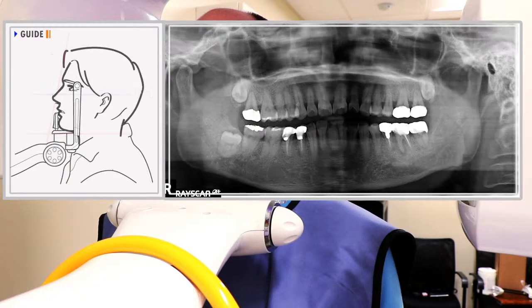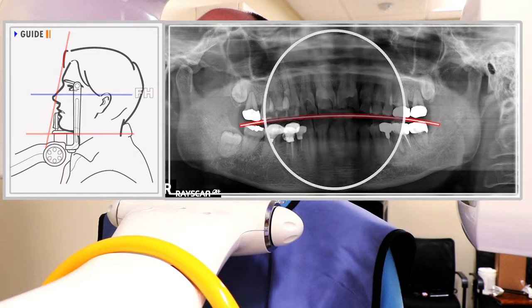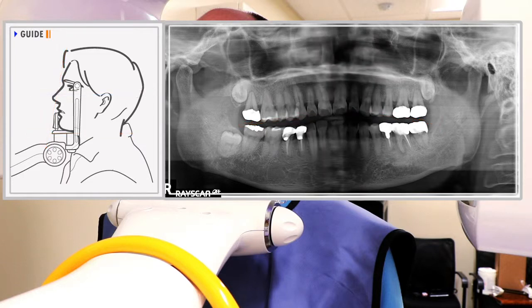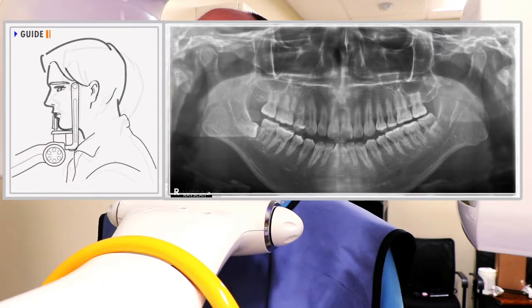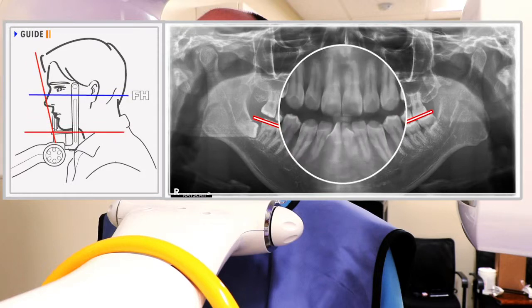If the patient's chin is too high, the anterior anatomy may be blurry and the inferior wall of the maxillary sinus may be difficult to visualize. If the patient's chin is too low, the anterior mandible may be blurry.